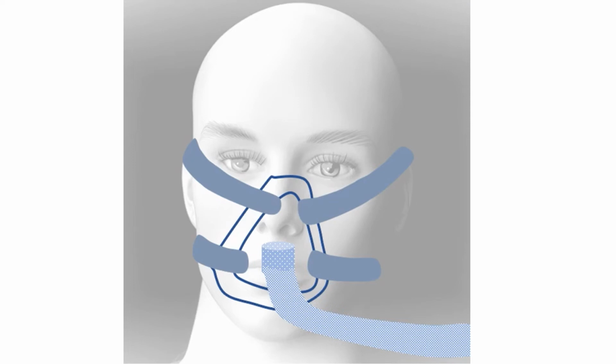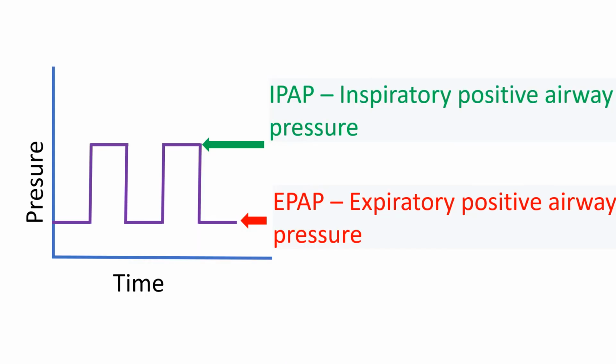Alarm settings have to be adjusted for the needs of the patient to avoid unnecessary alarms. The non-invasive ventilator usually supplies two levels of pressure, one during inspiration and another during expiration. Pressure applied during inspiration is higher than that in expiration. A simpler type uses continuous positive airway pressure, known in short as CPAP, mostly used for obstructive sleep apnea.